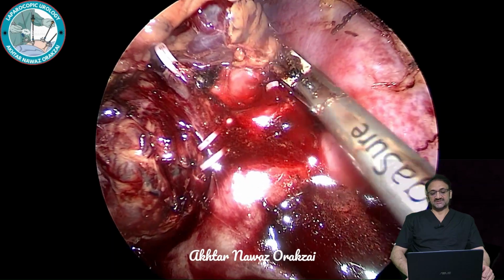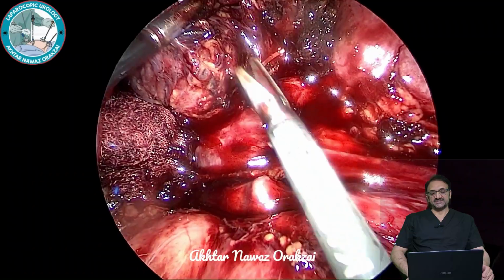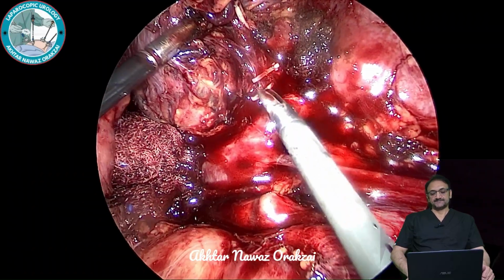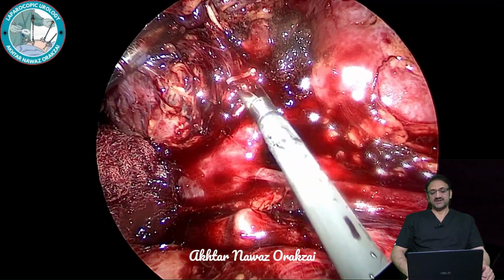So this portion is separated and the artery is preserved. Then the second vein is being cut slowly and gradually, bit by bit.